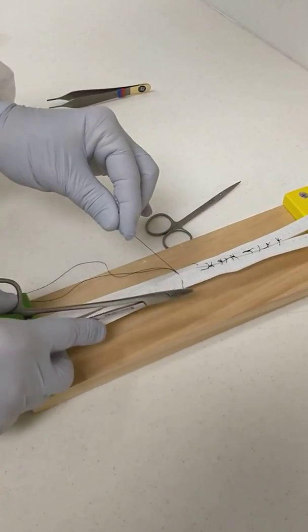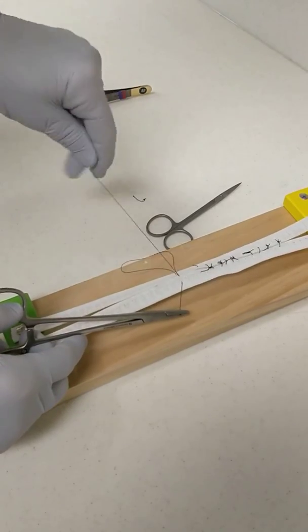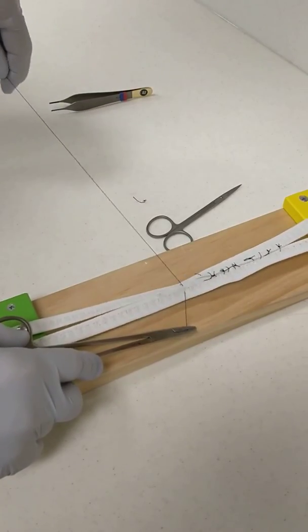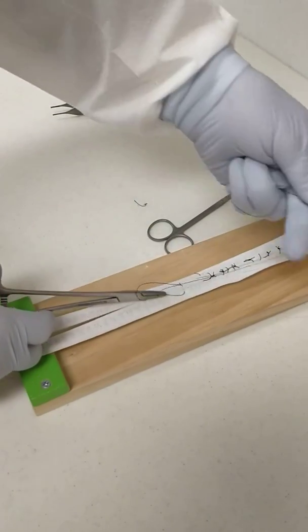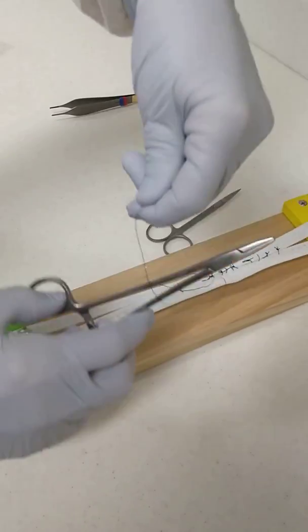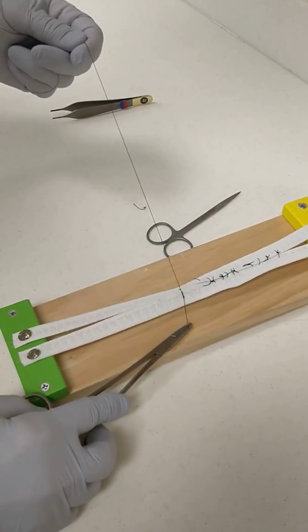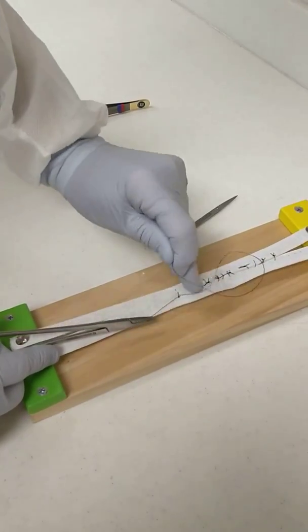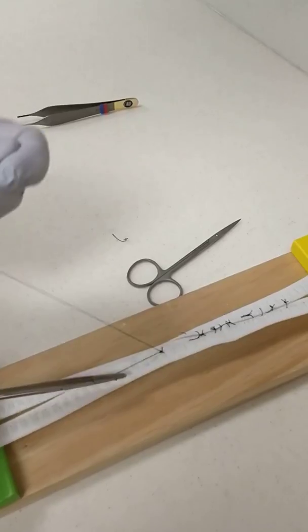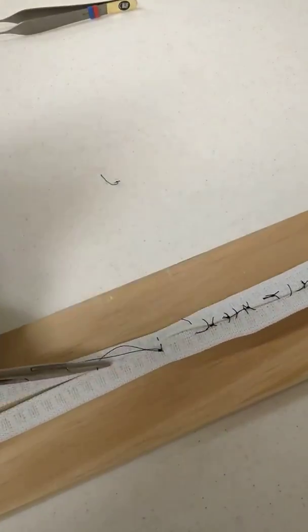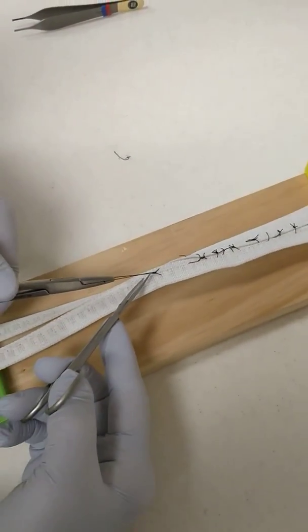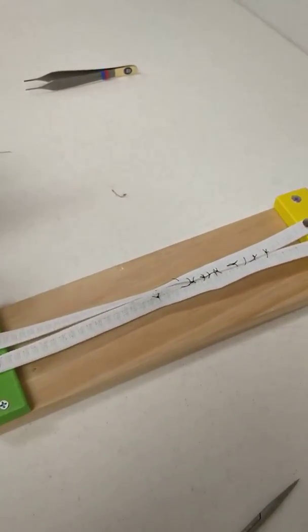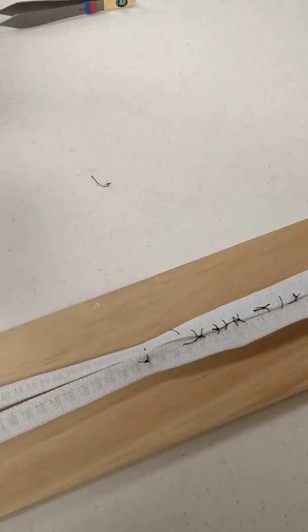When you pull these together, it tenses the tissue up so that the wound edges approximate themselves. And so you have more connective tissue in contact. This works best for skin sutures, but occasionally we'll use it in the mouth as well. That's the vertical mattress suture.